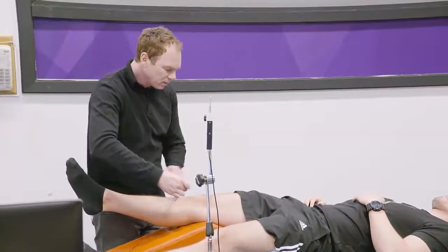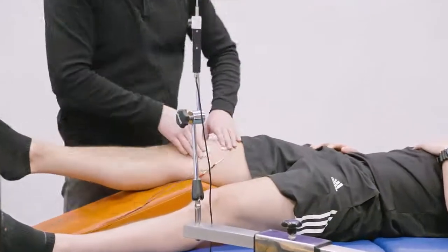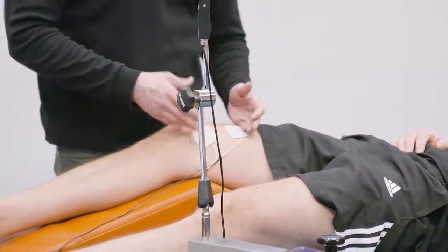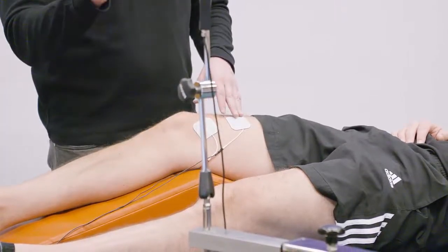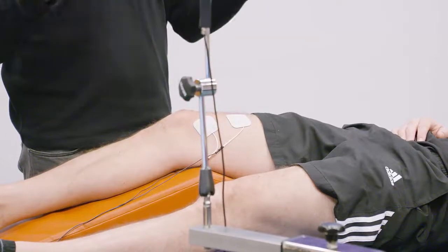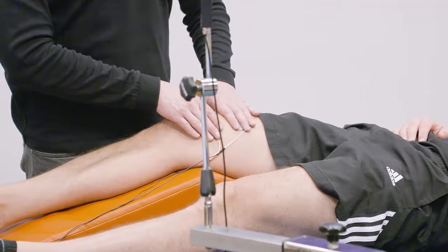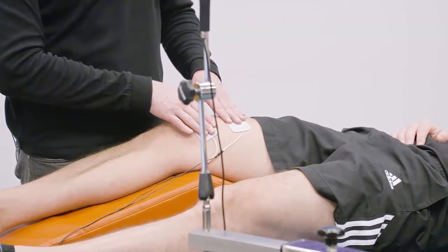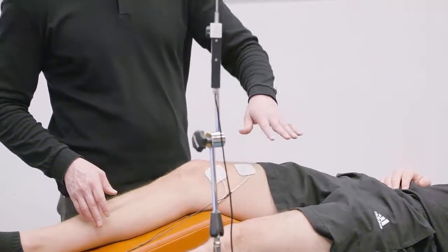Please extend your knee. I will measure in the center of the muscle belly. Relax. I put one electrode higher and one electrode lower — one proximal, the other one distal from the measuring point. The space between the electrodes is a few centimeters, and it all depends on how big the muscle is.